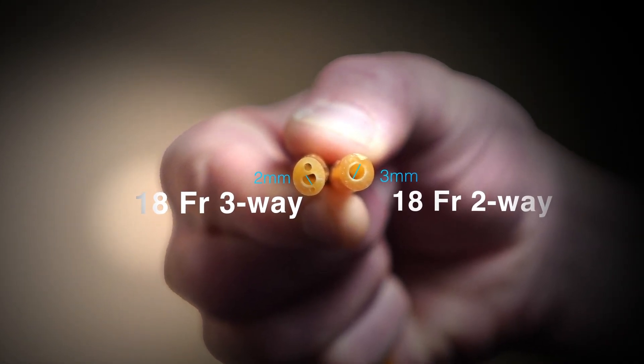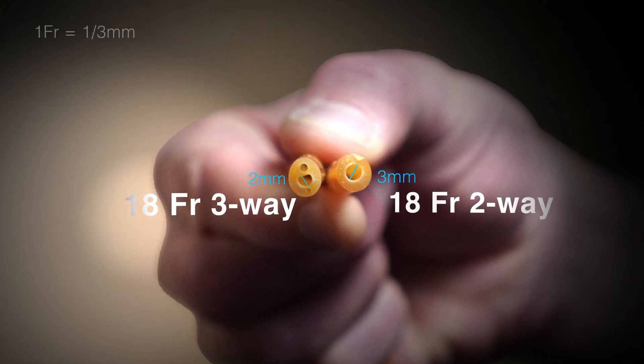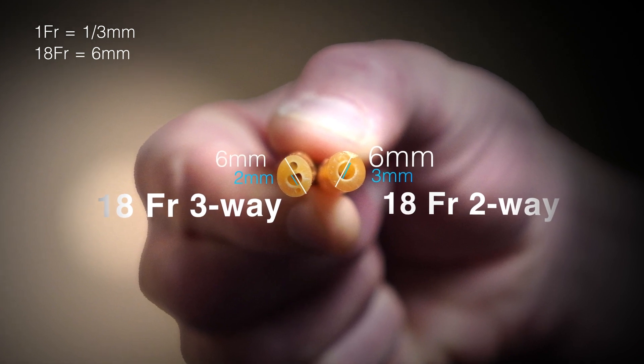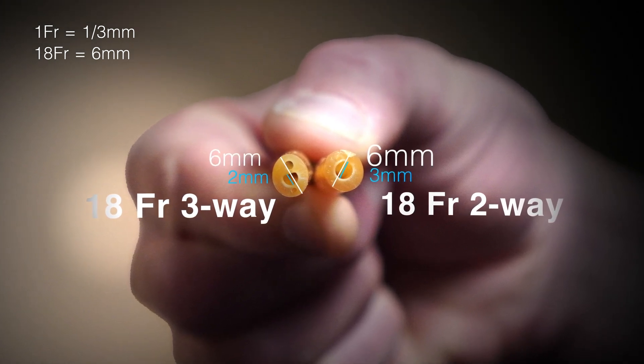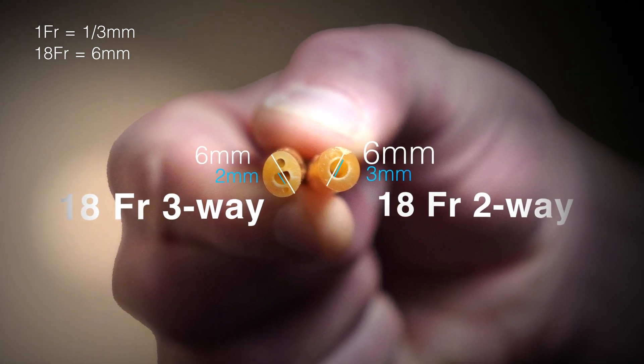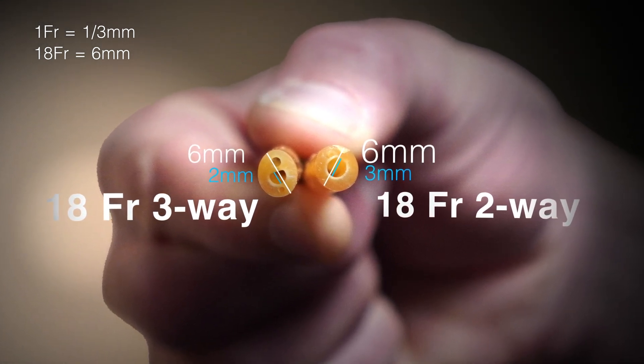The French refers to the outside diameter of the catheter. Thus, a three-way Foley catheter compared to a two-way Foley catheter of the same size has a smaller diameter of the outflow channel and may be a poor choice if we're deciding on a smaller catheter.